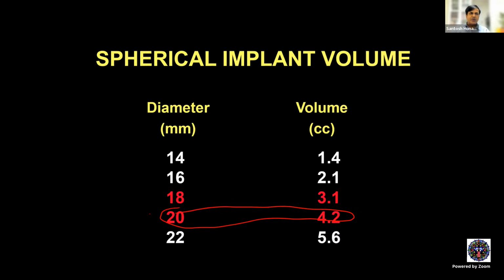Mooning is when you place an implant posterior to posterior tenons, provided there is no intraoperative hemorrhage, right? The implant should snugly sit in its position. It should not move anteriorly. The moment it starts spontaneously moving anteriorly, when you place the implant, like you put it, it just springs back. That's called mooning of the implant.